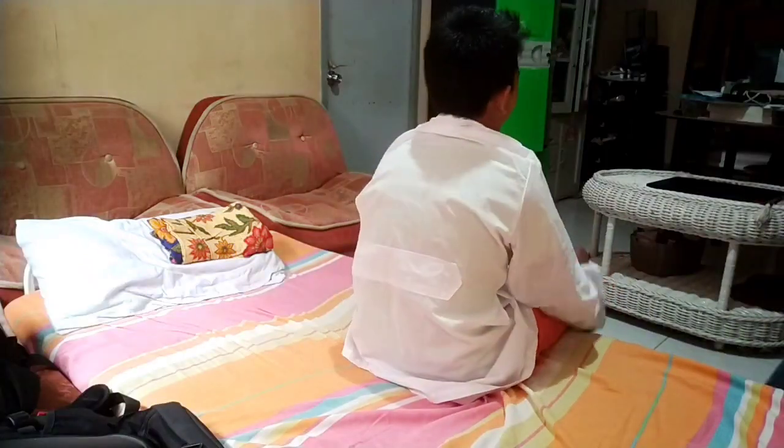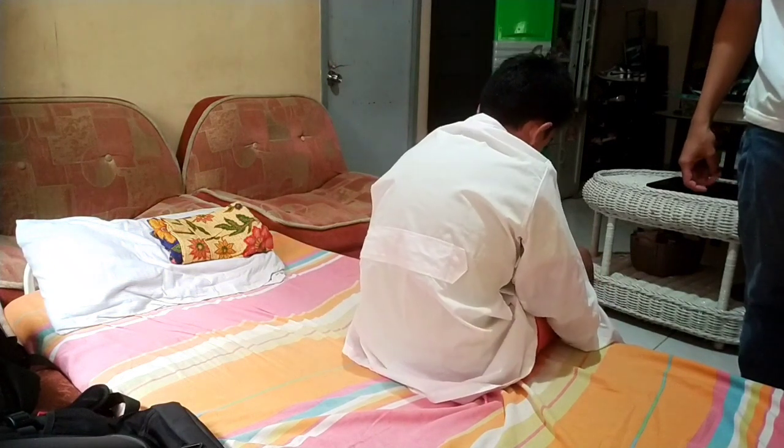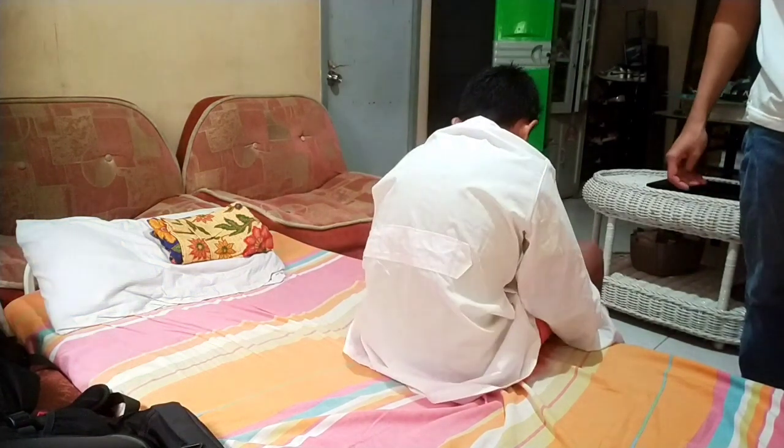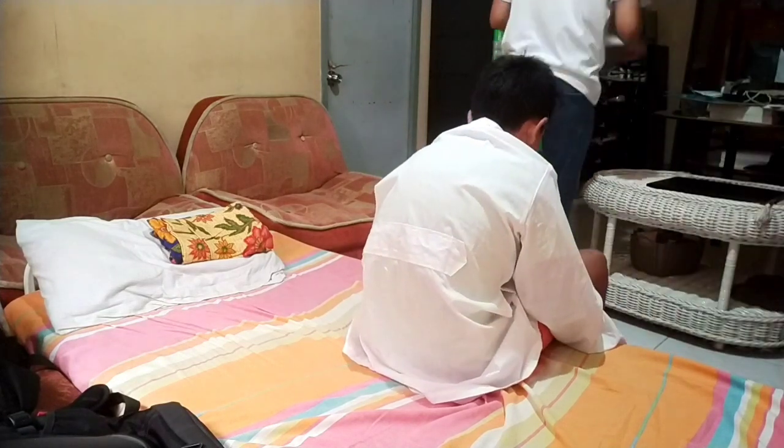So the next procedure is place a gait or transfer belt snugly around the client's waist. Check to be certain that the belt is securely fastened.